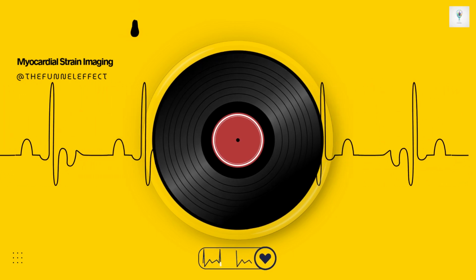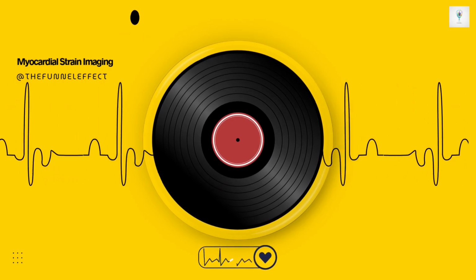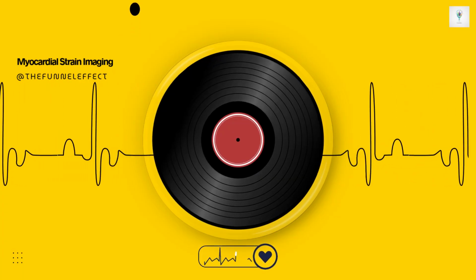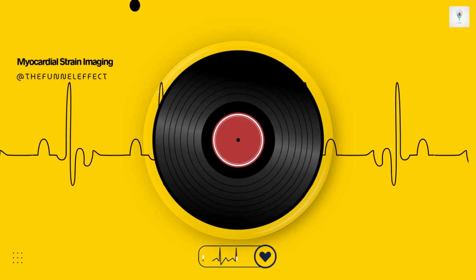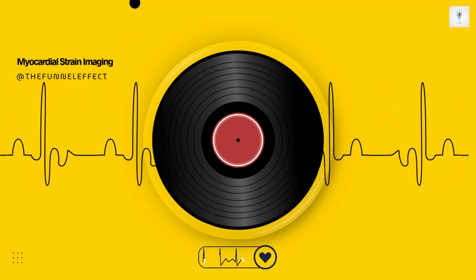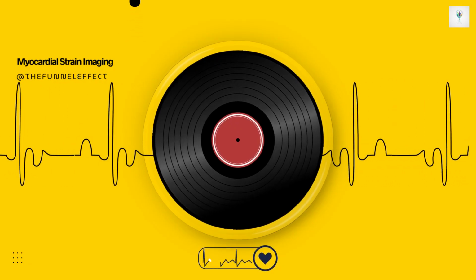But measuring it isn't always straightforward. The sources detail several practical pitfalls. Let's start with foreshortening. What is that? Foreshortening is a very common imaging error in echo. It happens when you acquire the apical view, the views from the bottom of the heart looking up, but you don't quite capture the true apex. You effectively cut off the bottom tip of the ventricle in your image. So you're measuring a ventricle that looks shorter than it really is.